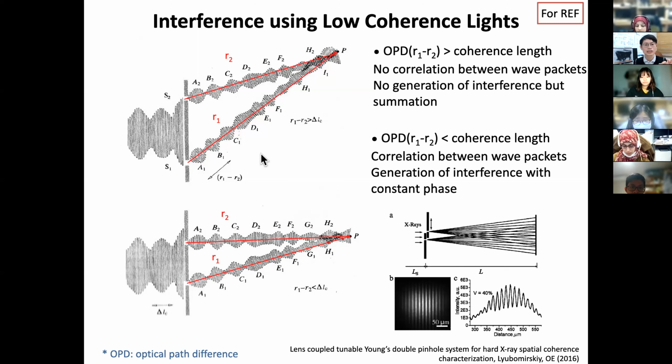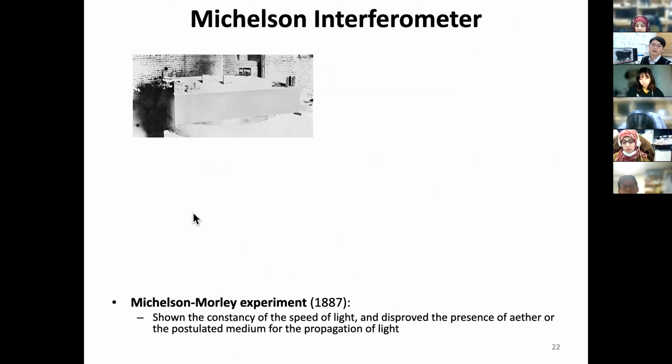And in OCT, we are actually utilizing this property of short coherence length. So the other name of OCT is low coherence interferometry. It's interferometry, but now we are not working with ideal, fully coherent light. We are taking low coherence as our concept.